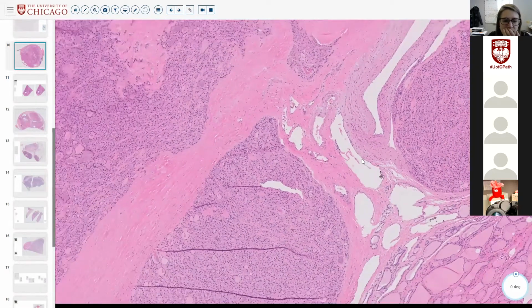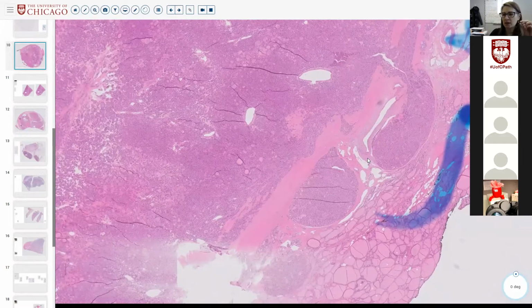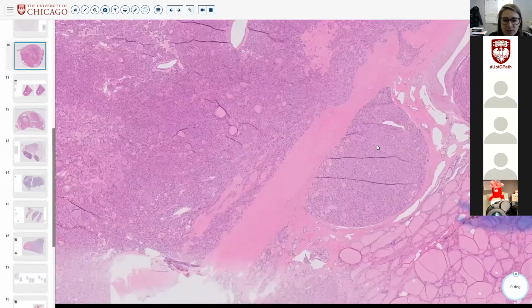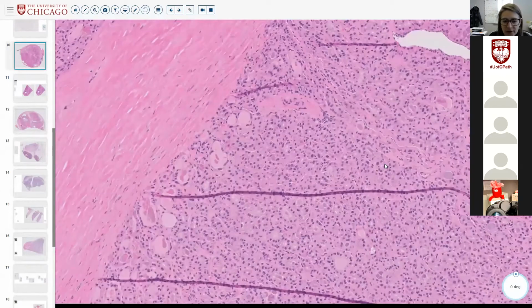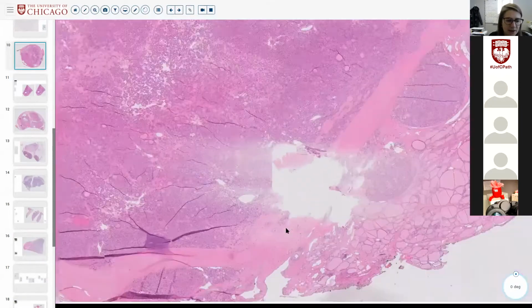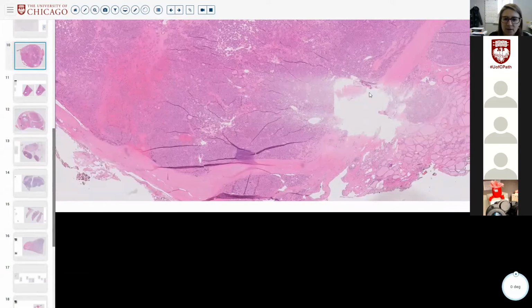These look like vessels, but sometimes you could see normal intervening follicles in these areas between the blips. That to me means these are punched out into normal, and normal is being invaded in between these blips. So I think this is real invasion. So then our diagnosis is right at the bottom, another mushroom. There's one here, there's one here.